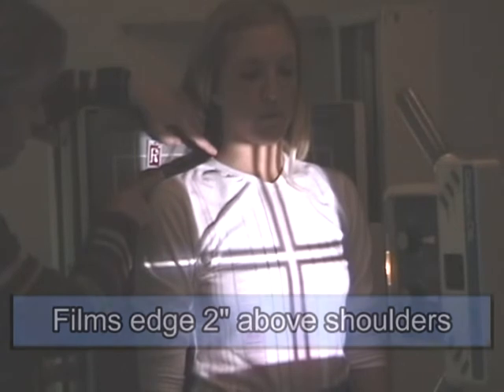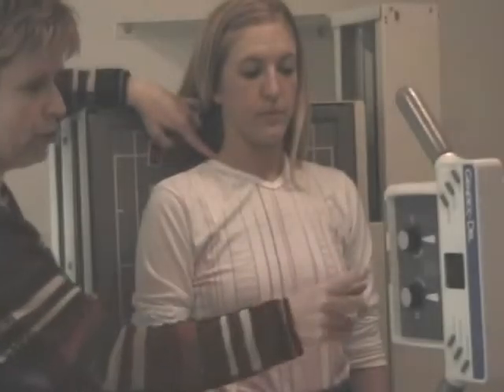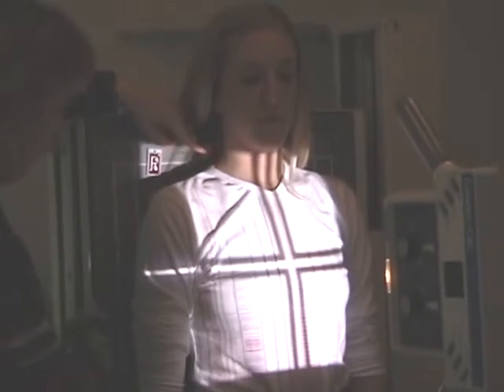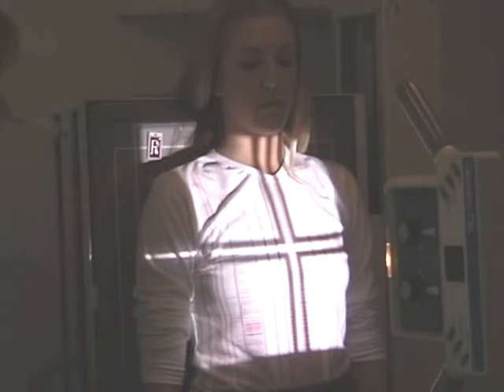A lot of students might think this is the shoulder, but you have to think about where the first rib is, and it's right here. So the film's edge should be 2 inches above the shoulder, and shoulder is now defined as over the apices of the lung right there. So I'm going to look and make sure my film's edge is 2 inches above, and it is.